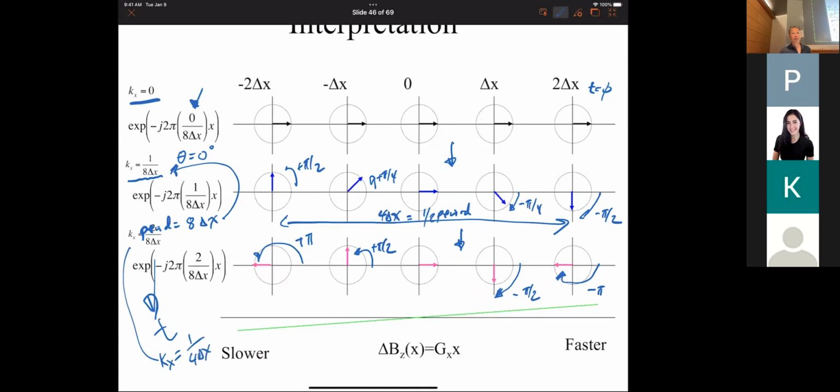All right. So the main point for today is that by using gradients, we can get these phasor patterns that correspond exactly to what we need for the Fourier transform. So at every point in time, these phasor patterns are the phasor patterns that the Fourier transform needs.